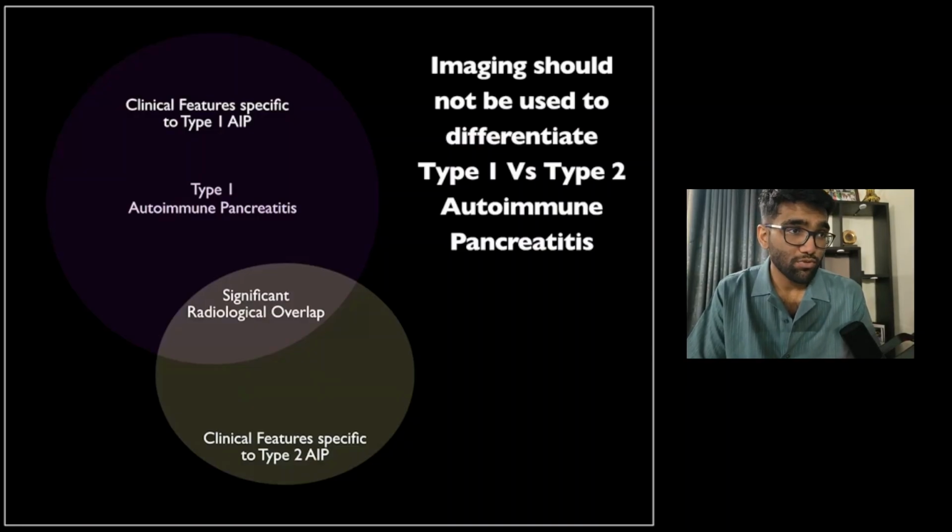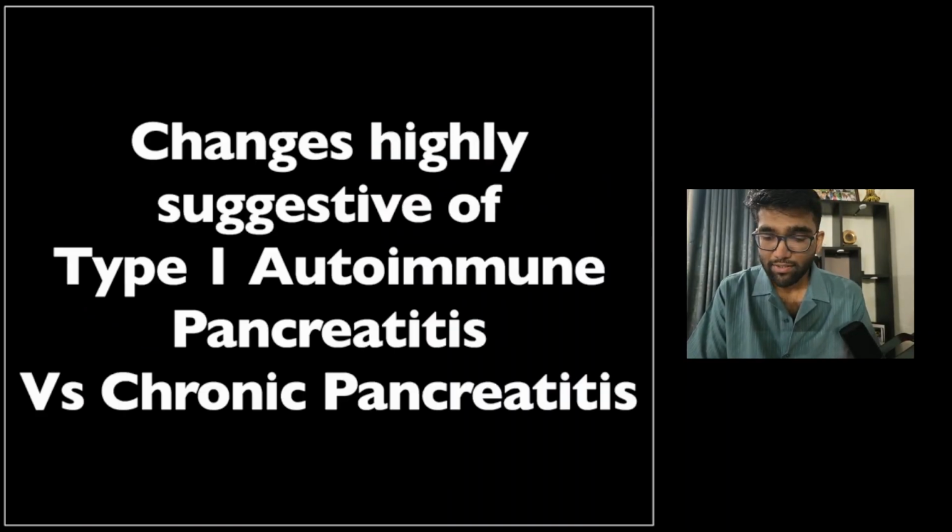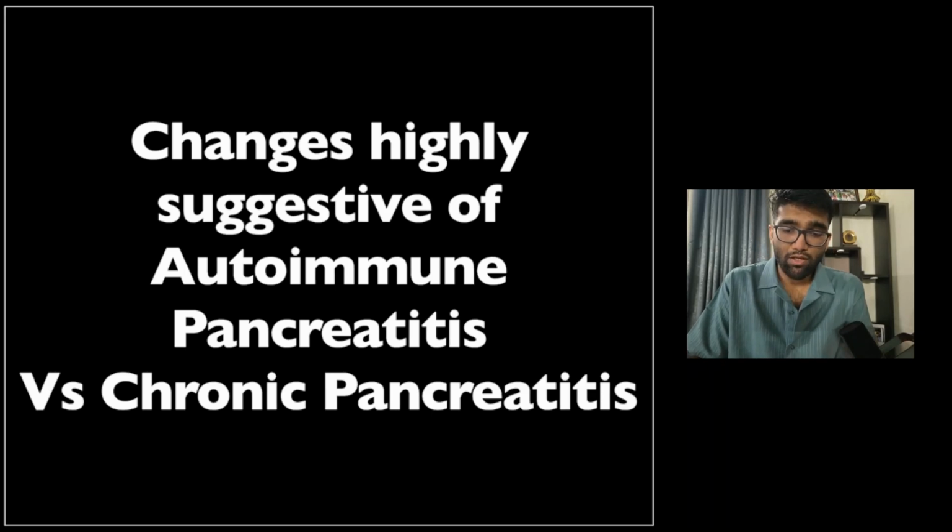So imaging should not be used to differentiate between these two types of autoimmune pancreatitis. Okay, now coming to changes in autoimmune pancreatitis versus chronic pancreatitis.